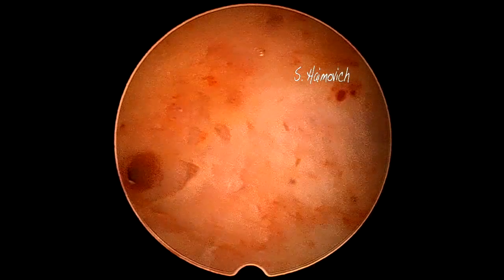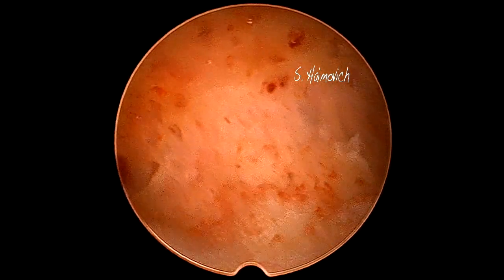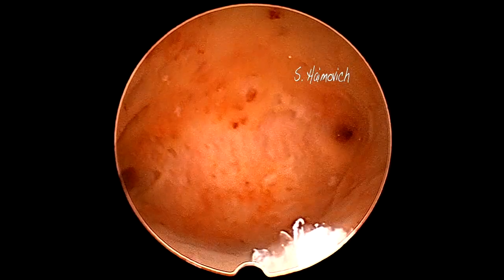Remember the images of the endometrium: sometimes we see the dark spots, and sometimes we can see old open cavities on the wall — all suggestive of adenomyosis.